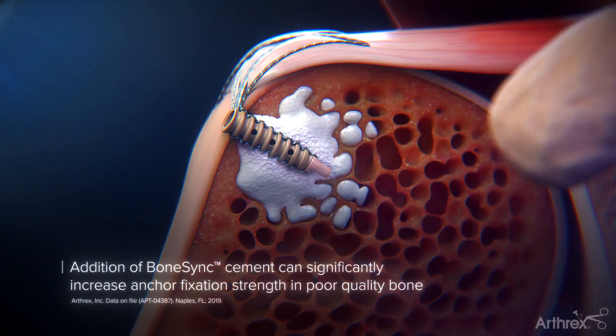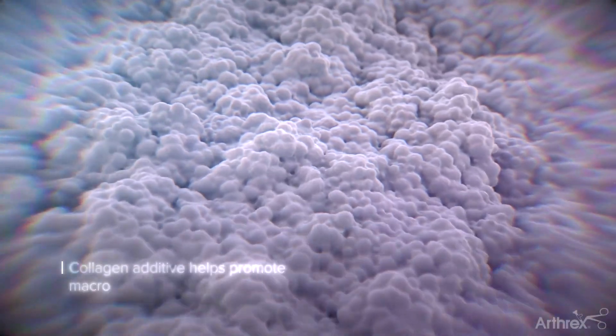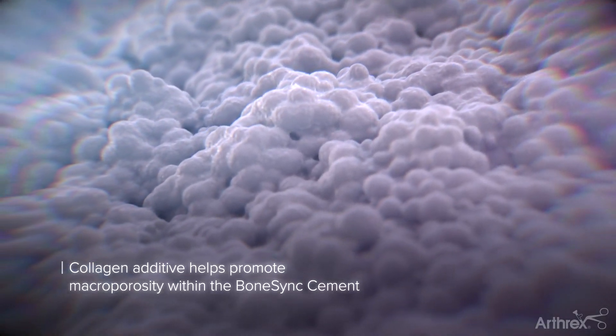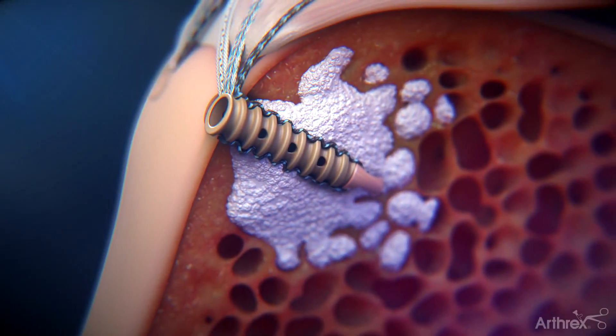Adding Bone Sync Calcium Phosphate Cement to the construct can increase anchor fixation strength. The collagen component of the Bone Sync Cement brings unique handling characteristics, including injectability, and helps to provide the macroporosity structure of the device. This macroporosity structure of the Bone Sync Cement allows for osseointegration, overall augmenting poor quality bone in the lateral row.